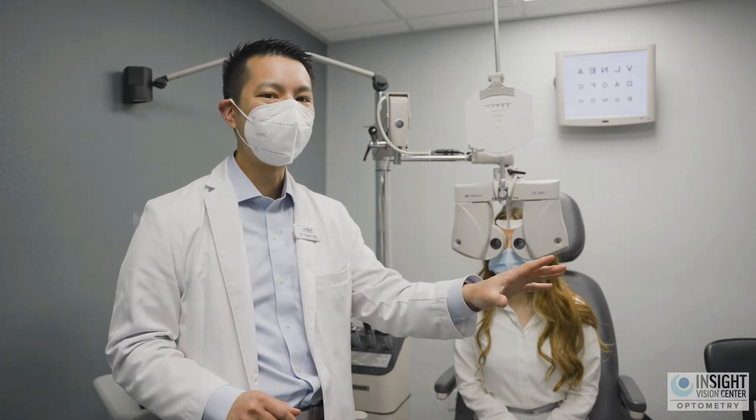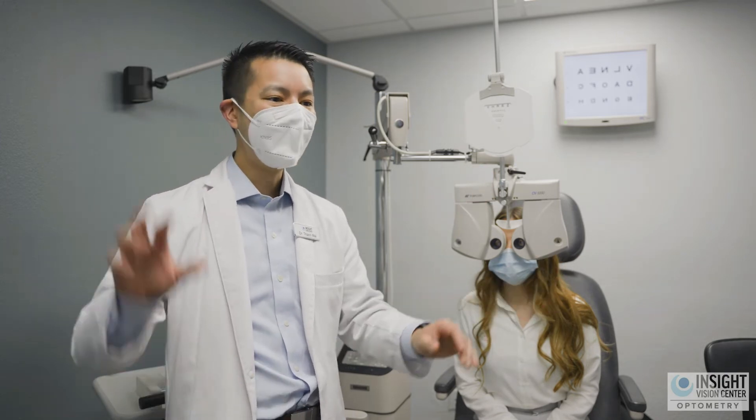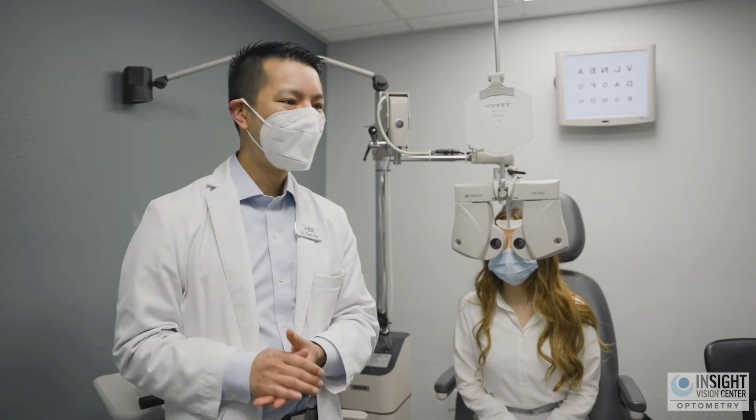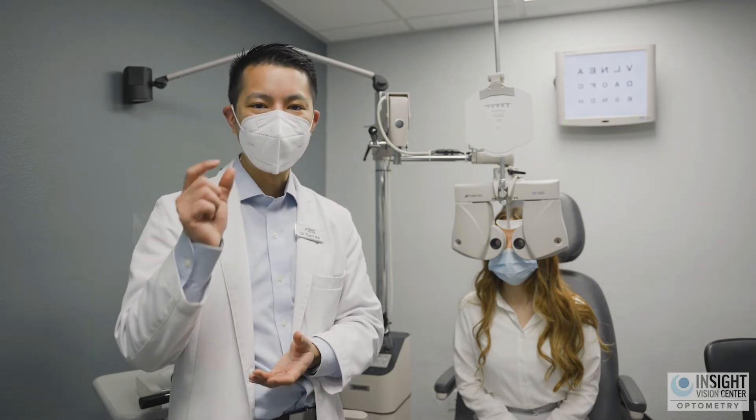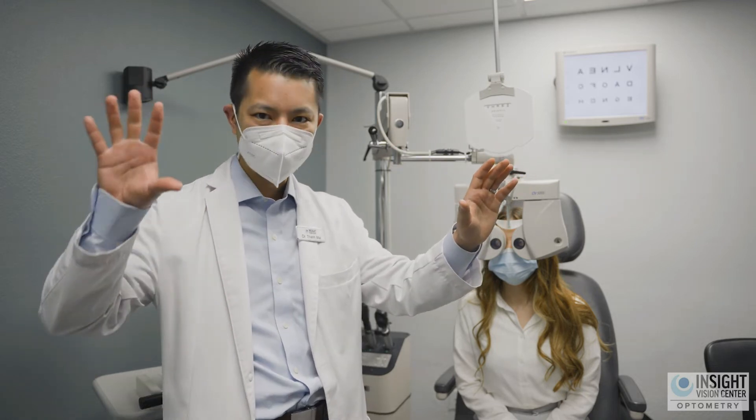The shape determines how comfortable, well-fitting, and healthy the lens will be for your eyes. The prescription determines how well you'll see — how well you'll read books, how well you'll drive your car. That's the visual component. So we need both: the shape of the lens, and then the prescription afterwards.